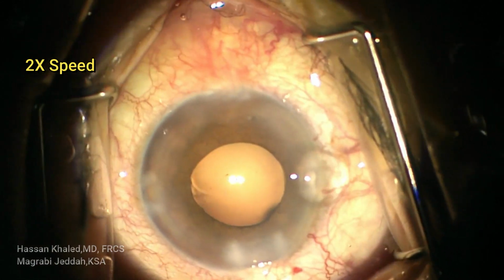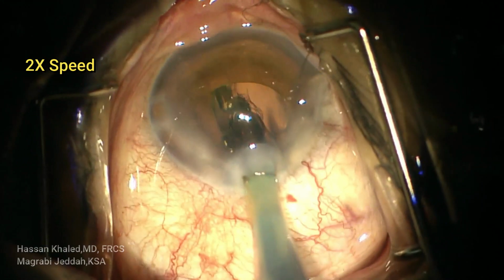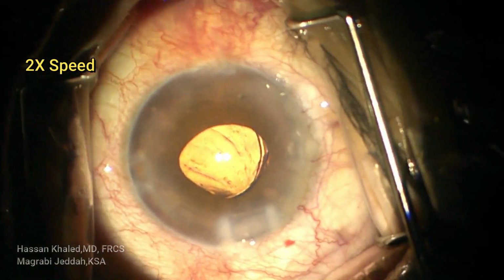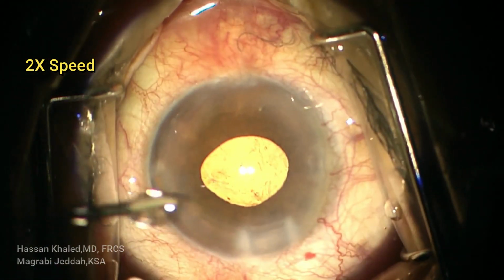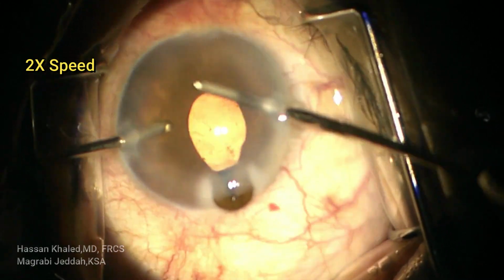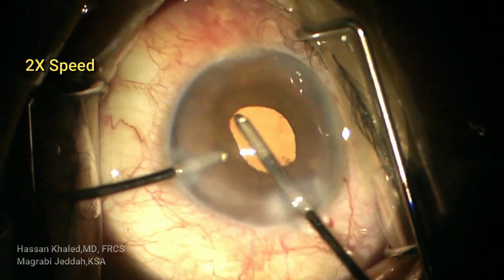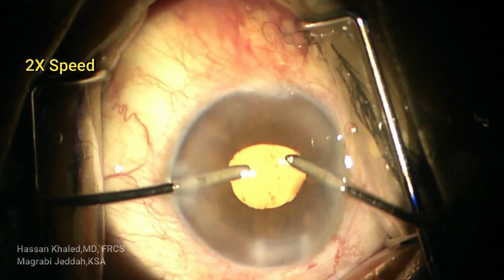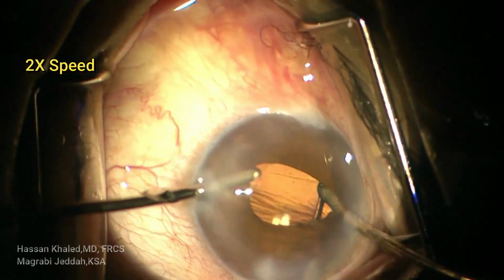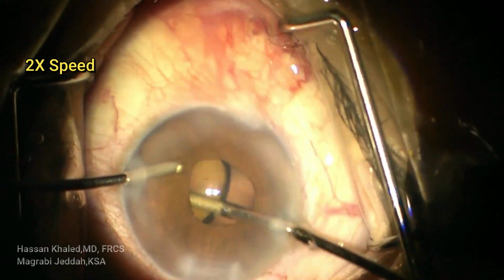And now it's time for implanting the IOL. After injecting the cohesive OVD, forming the capsular bag and inserting the single piece hydrophobic IOL, then washing the OVD anterior and posterior to the IOL. It's also important to remove all the OVD to avoid any spikes of IOP.